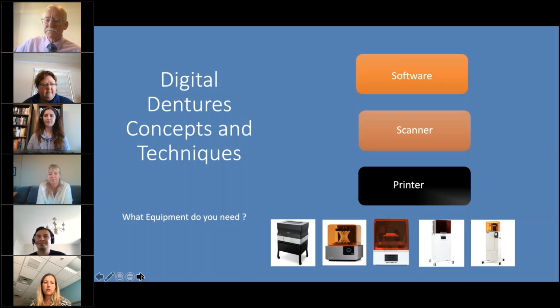I think it's great. I know people say the Asiga is open, but the NextDent isn't. But we found that the NextDent resins are very good resins, and pretty comparable in price, really. We haven't had any trouble with our printer, and I like it. So, what about Tanya? What printer have you got, or printers?